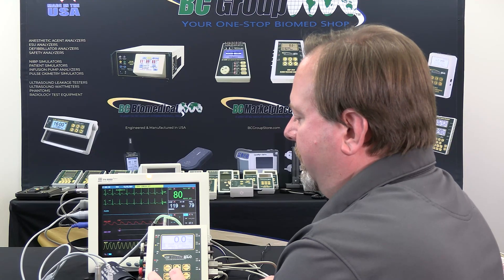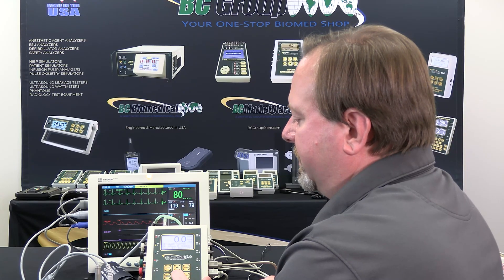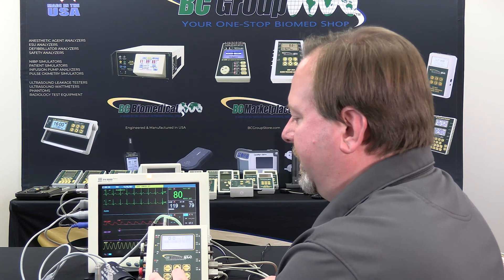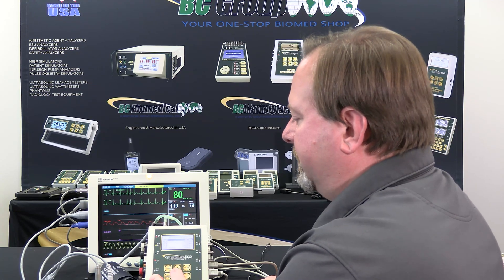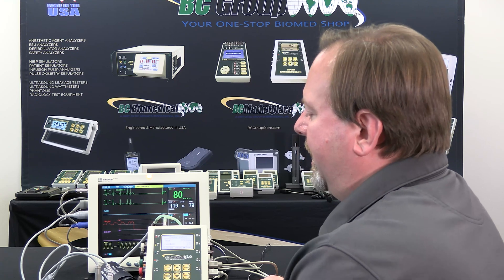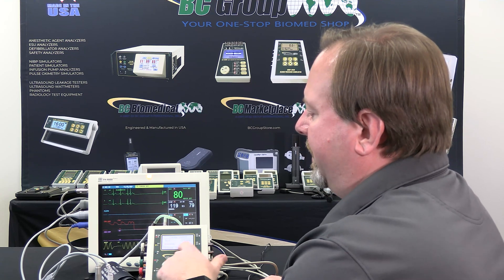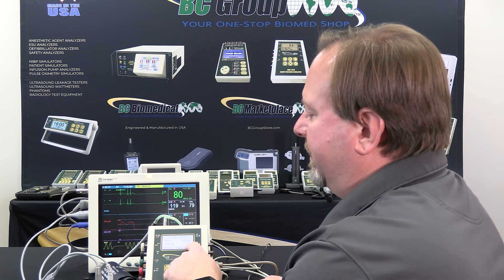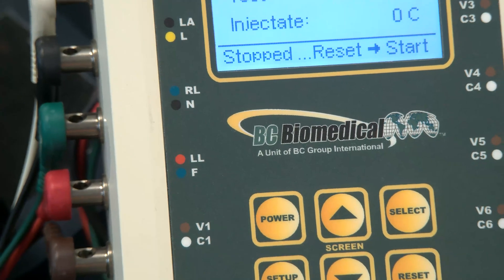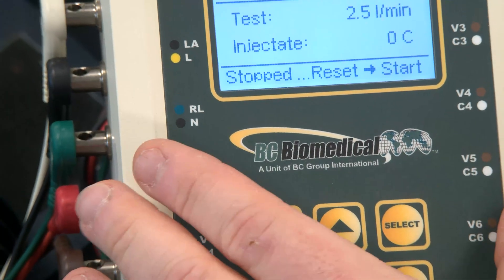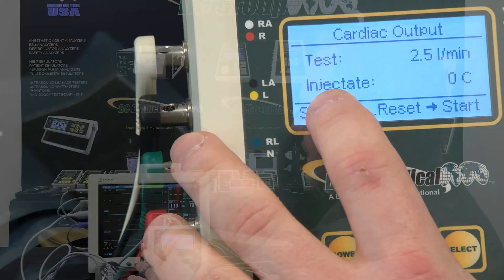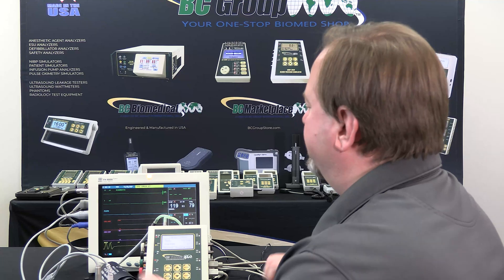We'll go in with the screen button and press the down button until we get all the way to cardiac output simulation. In this case we have the injectate set to zero degrees C, so we need to make sure that the monitor is also measuring zero degrees C for the injectate temperature.